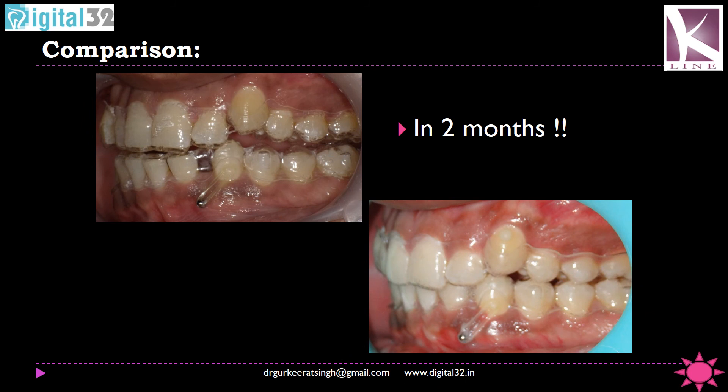This is a two-month comparison showing the amount of extrusion achieved and the amount of intrusion of the mandibular canine achieved using K-line clear aligners. You can make out that a phenomenal amount of space has been closed in the lower arch, and we have achieved intrusion of the mandibular canine — a very difficult movement to achieve using just aligners — as well as extrusion of the maxillary canine. These are very simple mechanics, nothing complicated, but there is a good amount of planning and good communication by the orthodontist with the lab to achieve this movement.